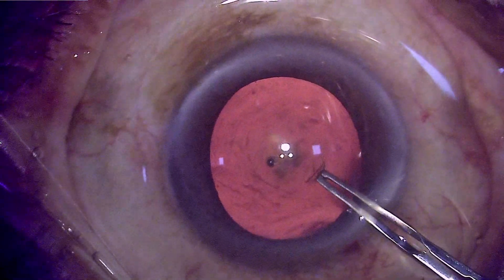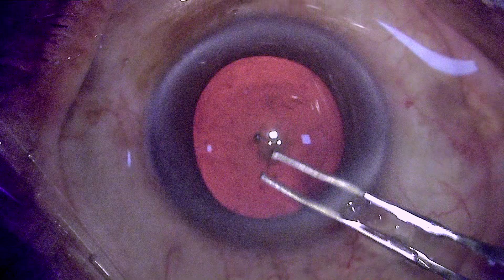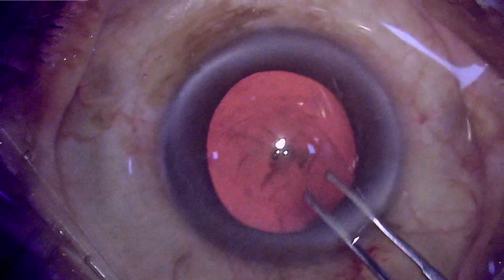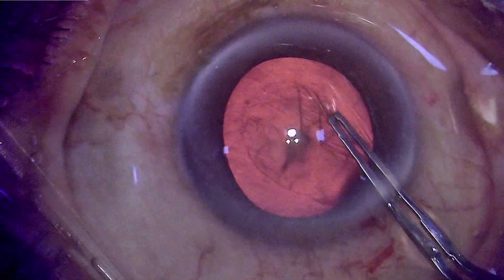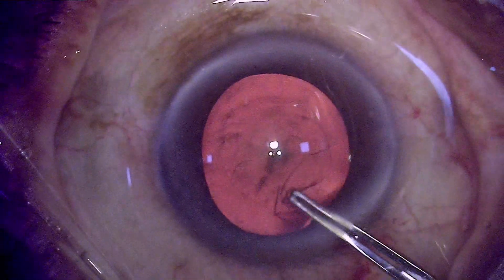The capsulorhexis is usually not very challenging in these patients because the capsule loses its elasticity, which is present in younger age, and hence the capsule is torn easily without any tendency for peripheral extension or spiraling out.